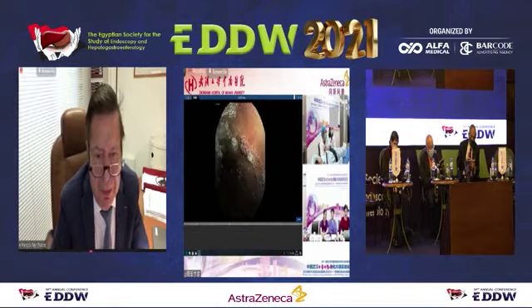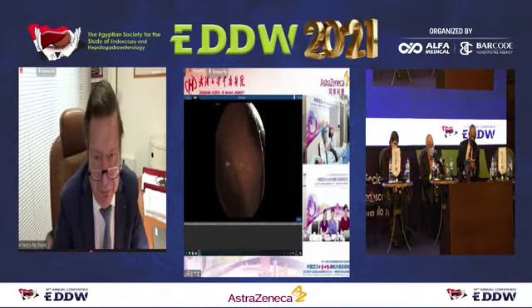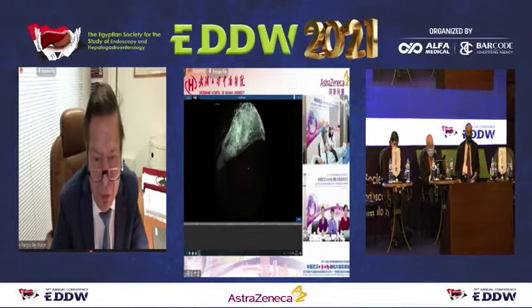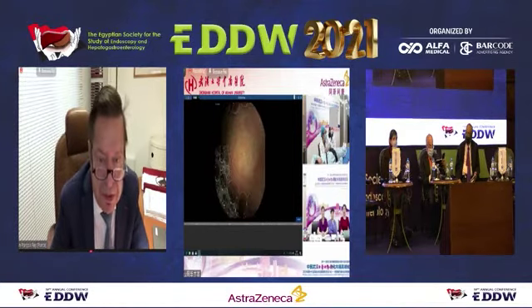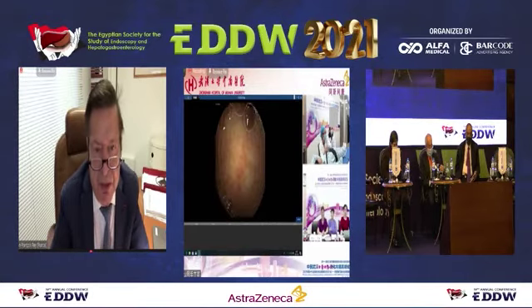In some cases, the capsule is able to diagnose small abnormalities. In some cases, the gastroscopy diagnoses other abnormalities. But the overall diagnoses are very similar. But we compared with a scope from 10 years ago. It was not a high resolution scope.